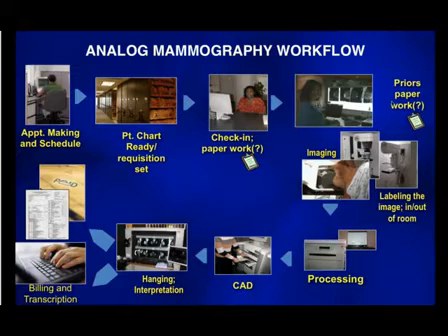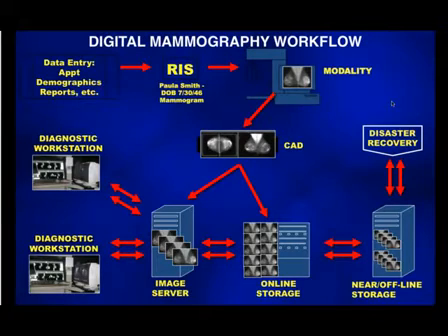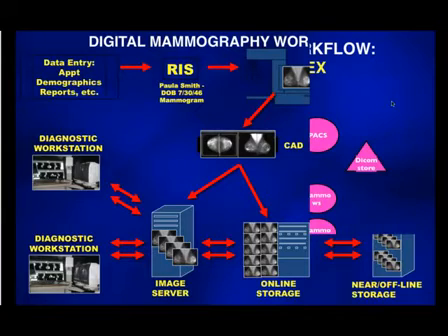Analog workflow, what a disaster. There's at least 15 or 20 more steps that are required compared to what we do now with digital, and it does it in a very convoluted way, labor-intensive at every step. Many more people involved than we can now with digital. Digital, again, has its own issues and its own steps, as you can see here, in a digital mammography workflow basis, but they're much more direct and much less human involvement needed once the system is set up to go. And this is a big, big advantage to all of us in terms of efficiency.